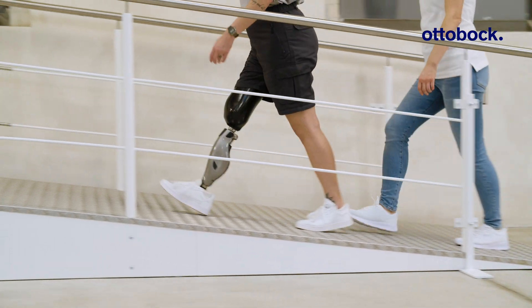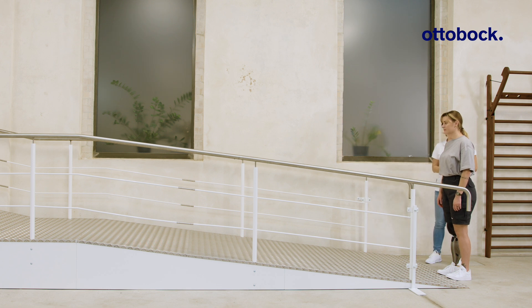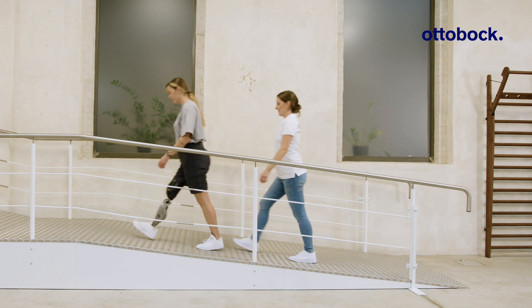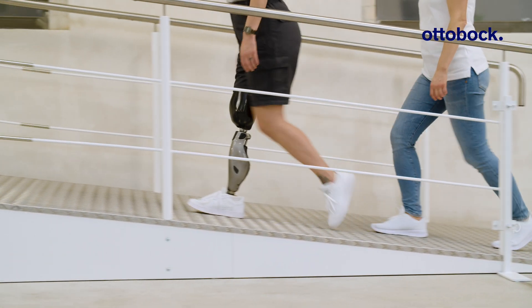Optimized slope ascent significantly eases uphill walking. As the pre-flexion angle adapts to the inclination and the knee joint stabilizes during stance phase to allow full loading, it becomes easier for the prosthetic user to shift the center of mass forward.